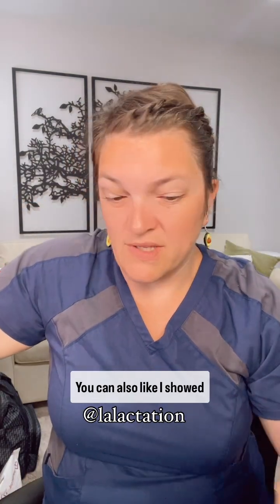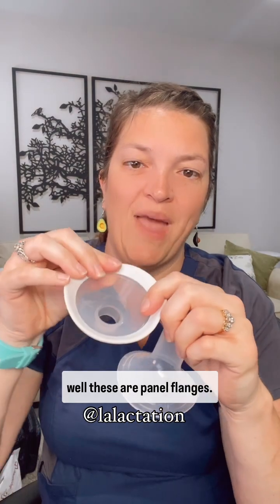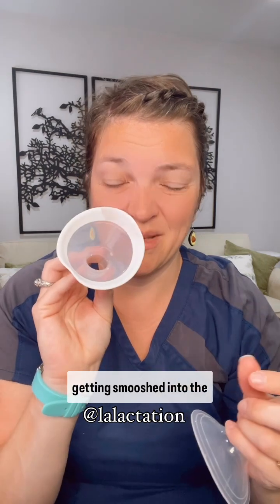You can also get oval shapes. These are Medela flanges, and these are panel flanges. They have this soft, comfortable silicone around the edge to prevent getting smushed into the bra.